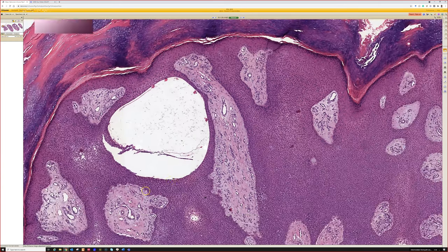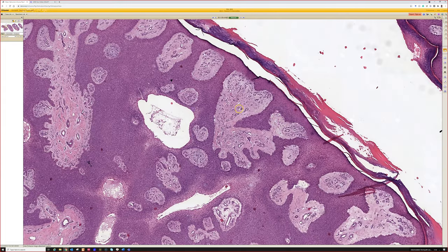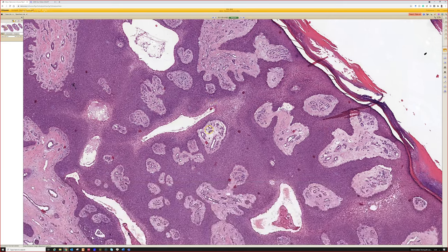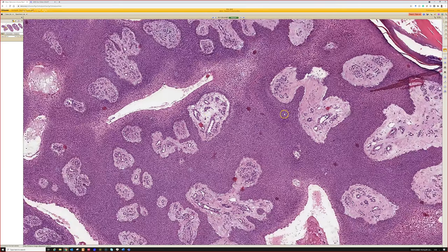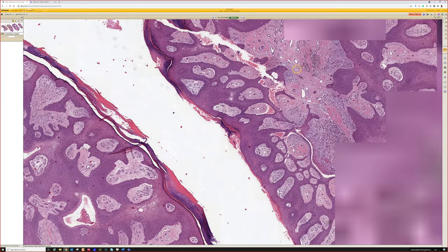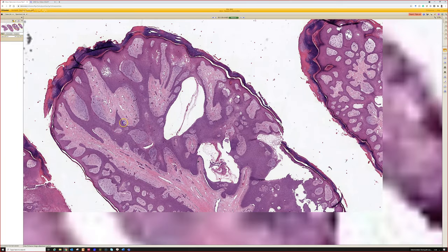Here's a dilated duct space. Also, poromas tend to be inflamed. They tend to have edema and a loose edematous stroma like this with big dilated blood vessels. They tend to be ulcerated a lot of times by the time you biopsy them. I feel like this one has an ulcer on top of it somewhere, if it'll load here.